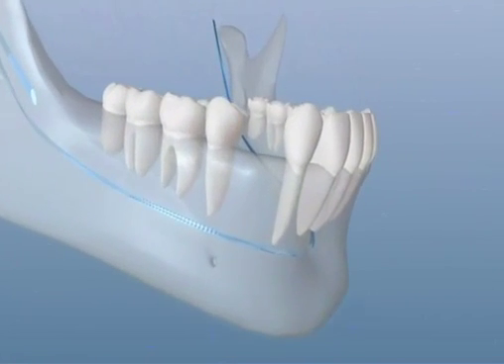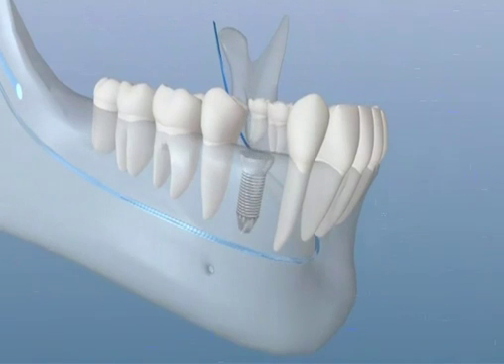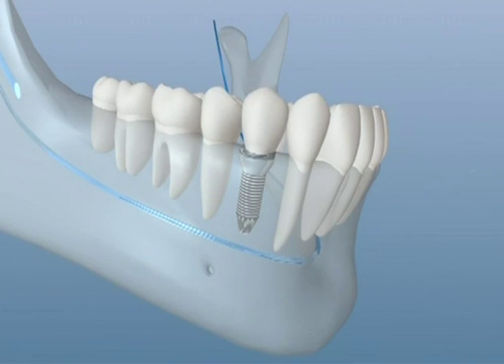A single-stage implant has an extension that protrudes slightly above the gums. In selected cases, the implant may be surgically placed, a cap-like extension attached, and the implant immediately restored with a temporary crown. We call this immediate restoration. In other cases, your surgeon may choose to wait to place the temporary crown to allow the bone to more tightly fuse to the implant.